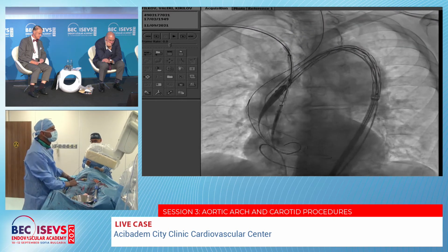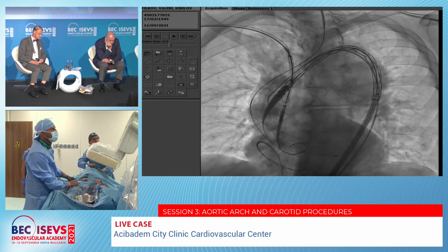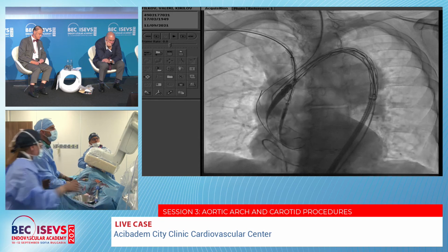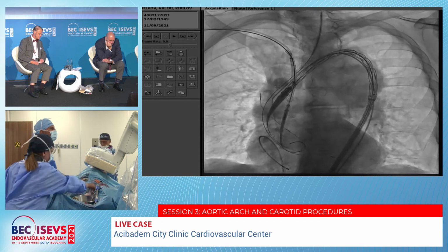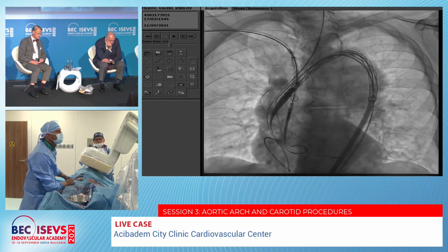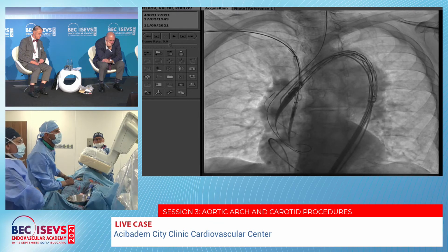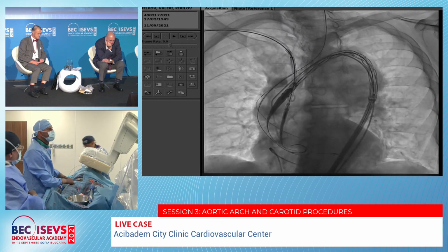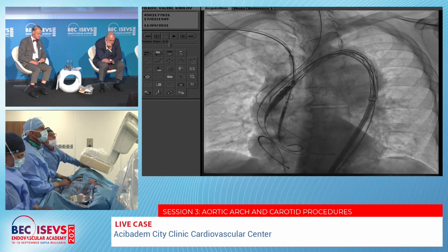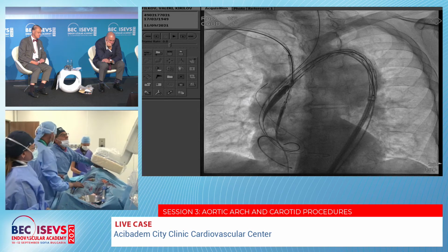Great. Okay. Yes. Okay. Great. Yeah, it's much better. Yes.